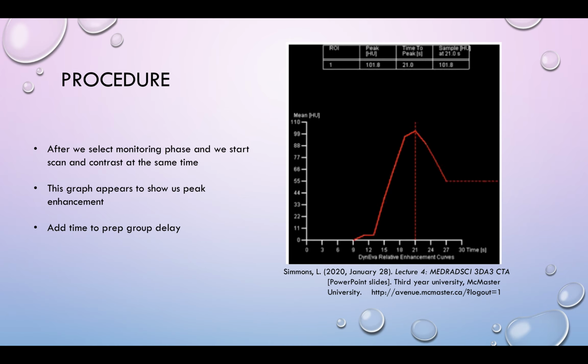Get them to stay in the department for 15 minutes to make sure there's no allergic reaction to the contrast, and tell them that their doctor will get the results in 3 to 5 business days. You may dismiss the patient and clean the room.